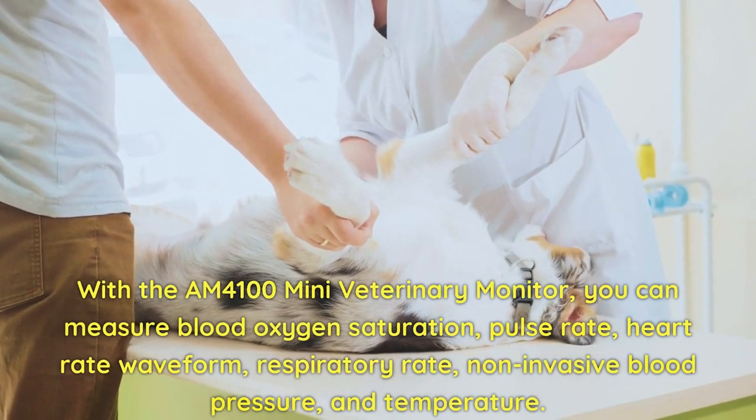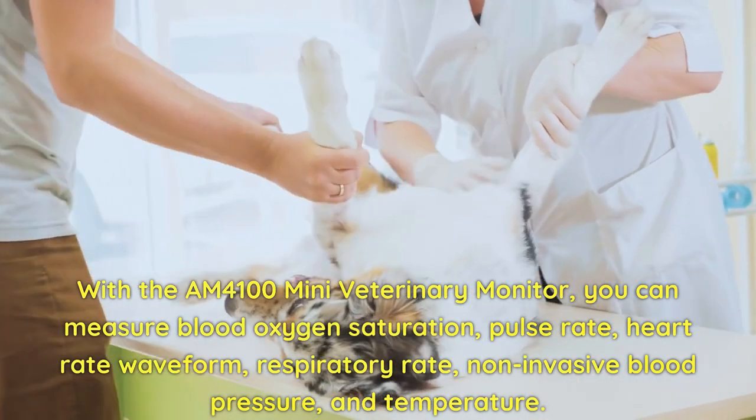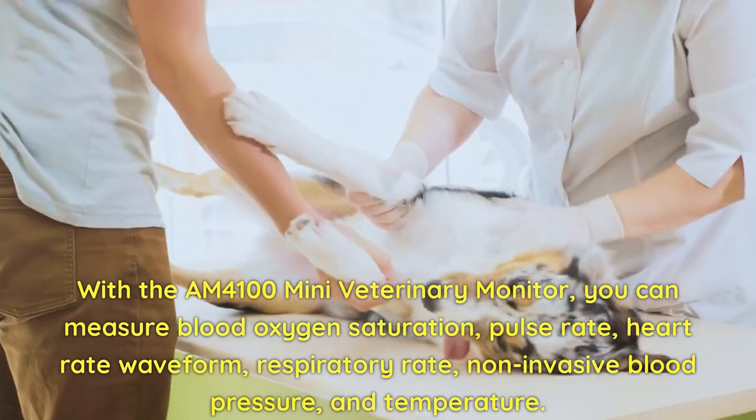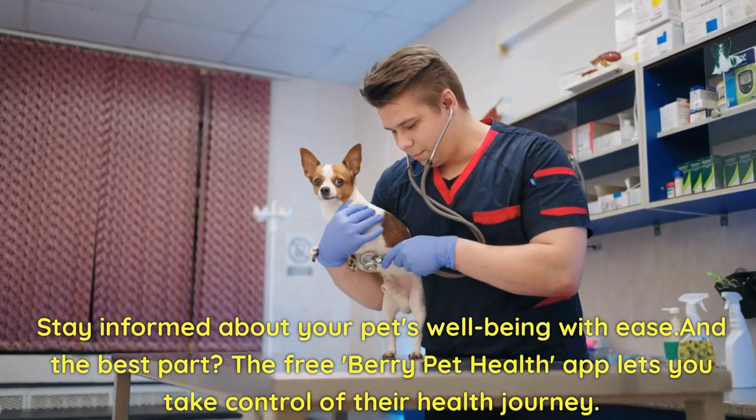With the AM4100 Mini Veterinary Monitor, you can measure blood oxygen saturation, pulse rate, heart rate waveform, respiratory rate, non-invasive blood pressure, and temperature. Stay informed about your pet's well-being with ease — and the best part?